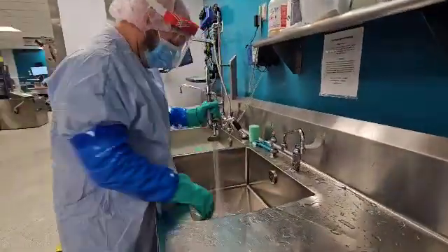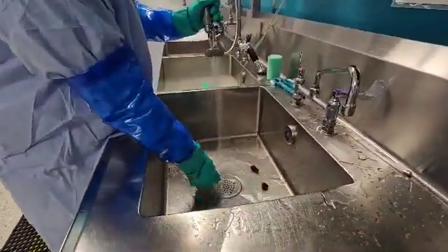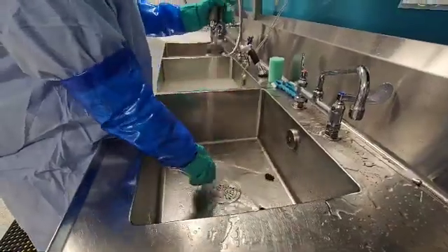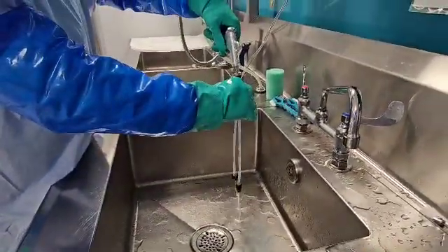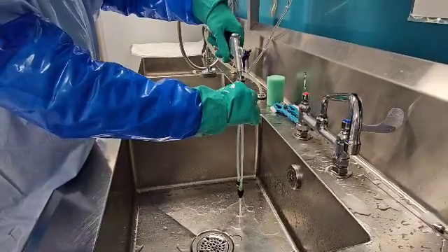Welcome back to WDYD CSP — What Do You Do as a Central Sterile Processor. Today we're going to manually clean an endoscopy accessory. This is the suction cleaning adapter.